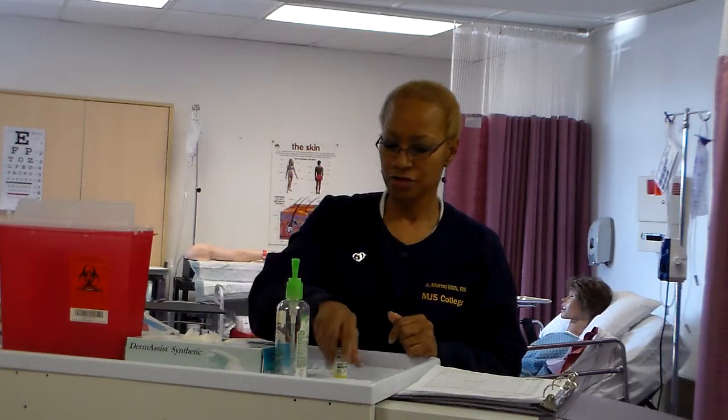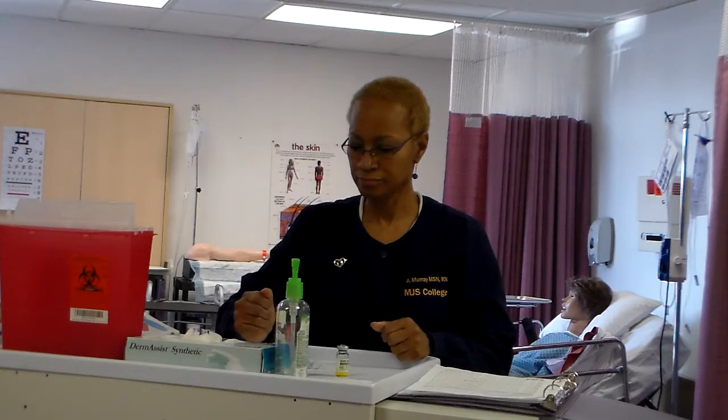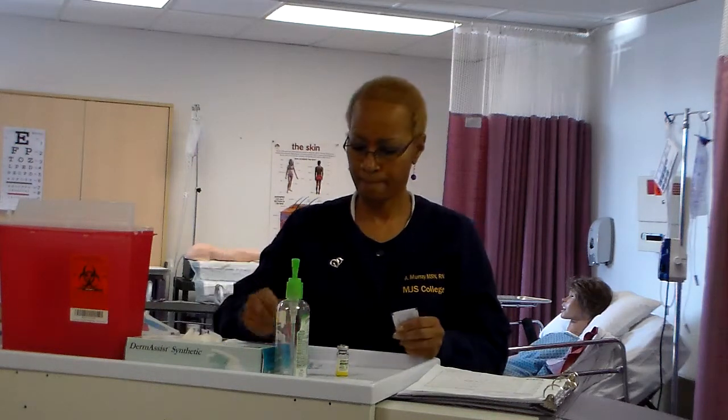Vial containing a solution. Okay, so that's our first medication using an ampule. Your next one is your vial using a solution. A vial can be either glass or plastic. Remove cap covering top of unused vial to expose rubber seal, keeping the rubber seal sterile.